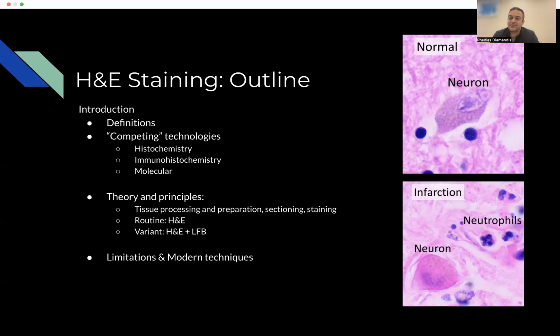primarily the subjectivity of the H&E stain, and how some modern techniques like artificial intelligence and computational histopathology are really revitalizing H&E stain as a very powerful tool in the modern era of precision medicine. So we'll quickly go over some of these concepts, which are discussed in more detail in other episodes found on this channel. And here we have some images, so we might as well discuss them.